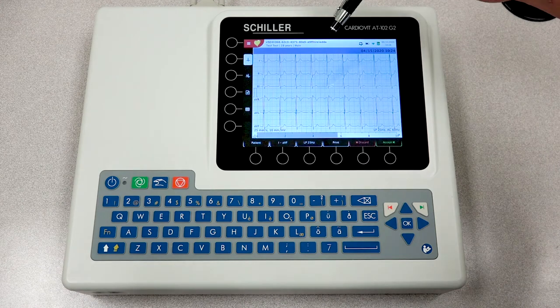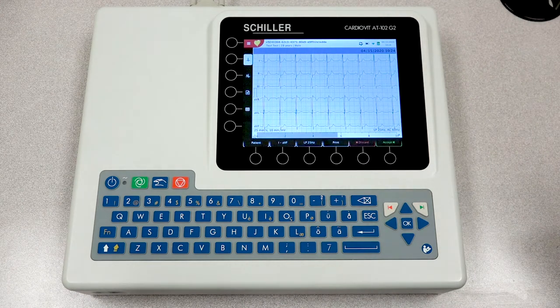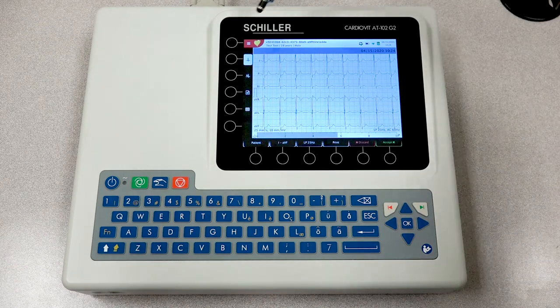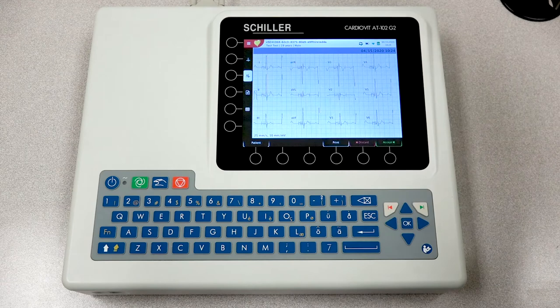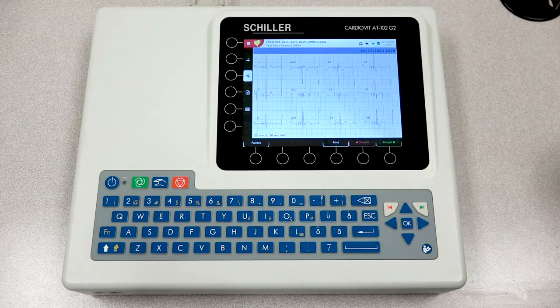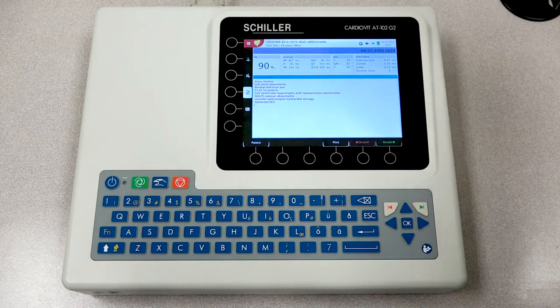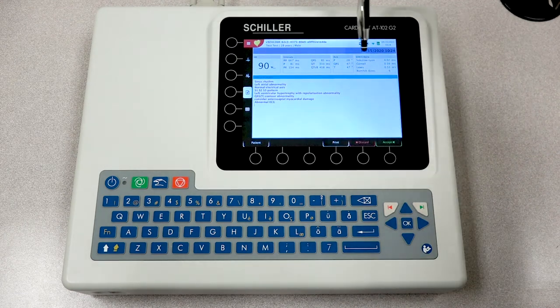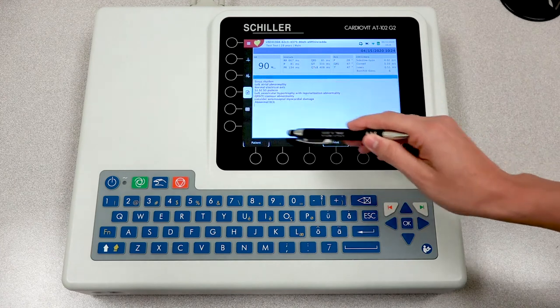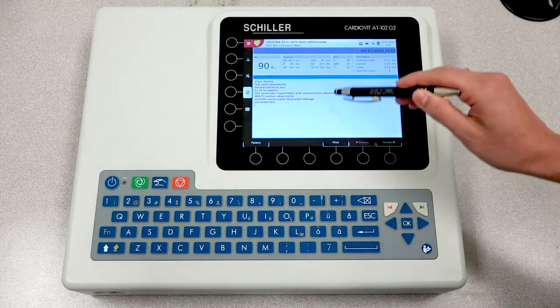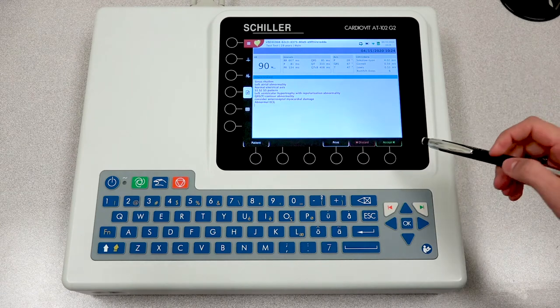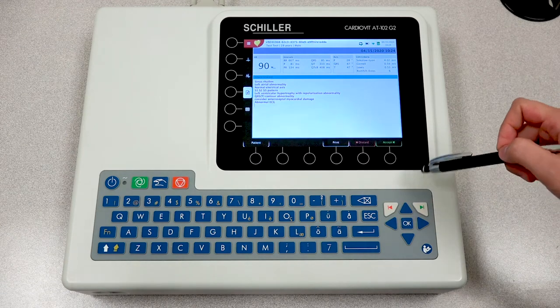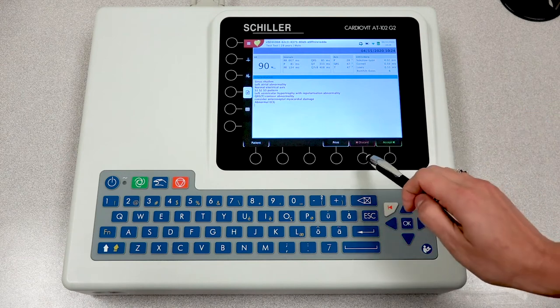The unit will demonstrate the resting ECG. You have the ability to navigate through and see the averages. Here you will find your main values and your entire interpretation. If the doctor or the nurse agrees, they can move forward and press accept. If they choose to discard, please select discard.